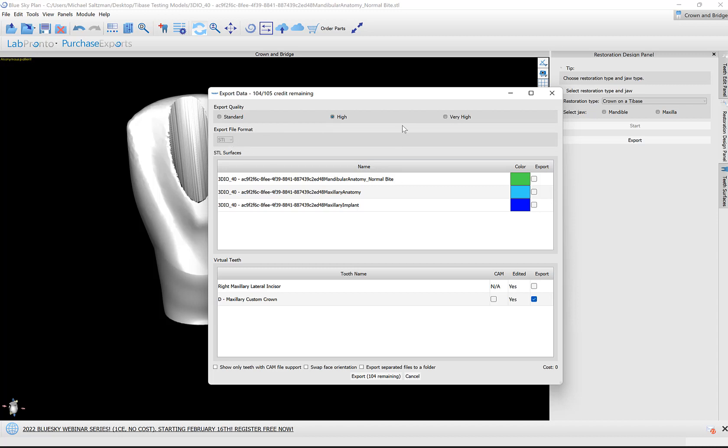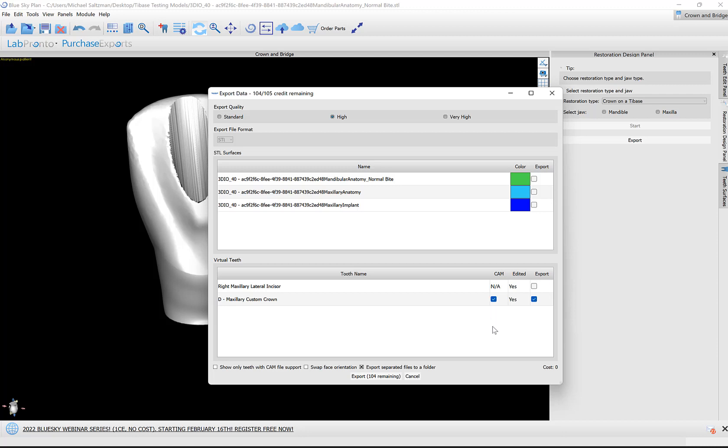We have a list of our surfaces. If we wanted to export anything else, we could check the checkbox. Our D file here is our designed crown. The export column is to export to STL. The CAM column is to also export to an XML configuration file for milling, not printing. STL files for printing. So I'm going to select both options.